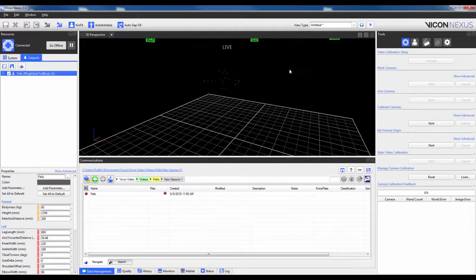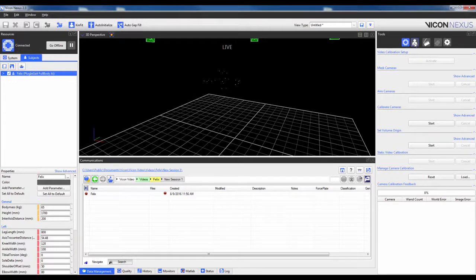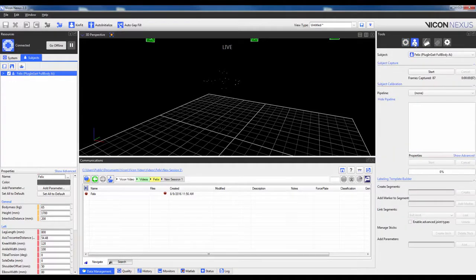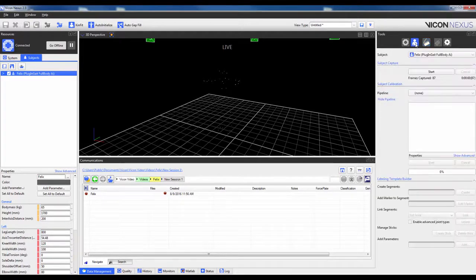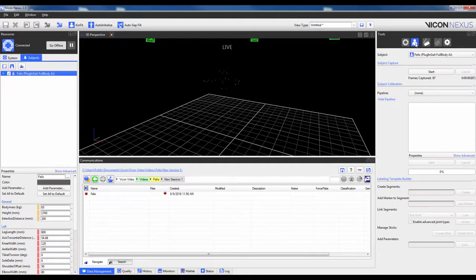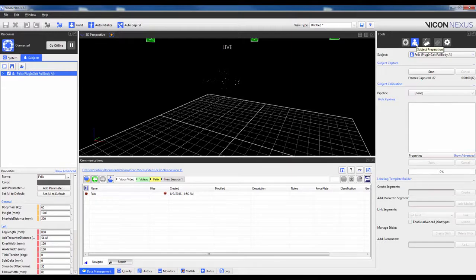In terms of recording the calibration trial, this can either be done from the Subject Preparation tab or from the Data Capture tab. The main differences of capturing within the Subject Preparation are that the trial name will be based off of the subject name, with the suffix cal appended, and that analog and video data will never be captured. If you want either of these two options, you will have to capture from the Data Capture tab.